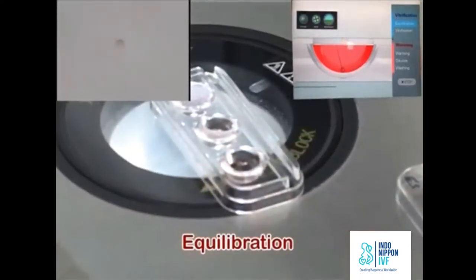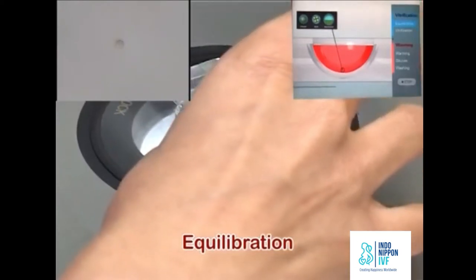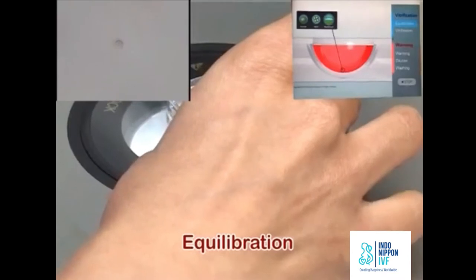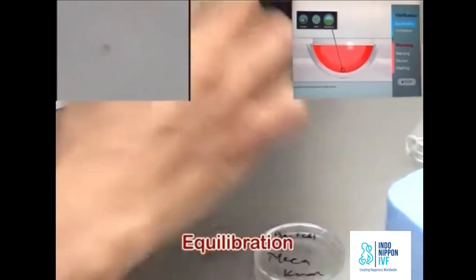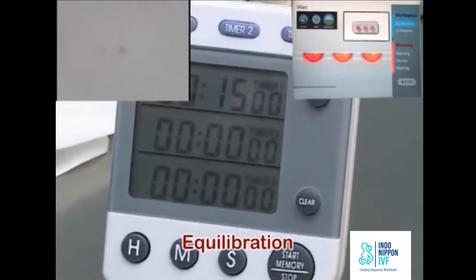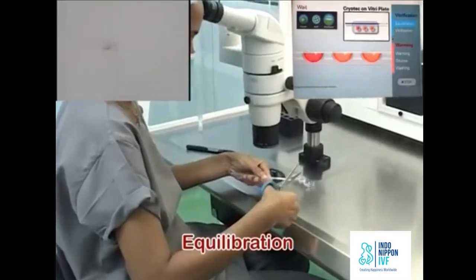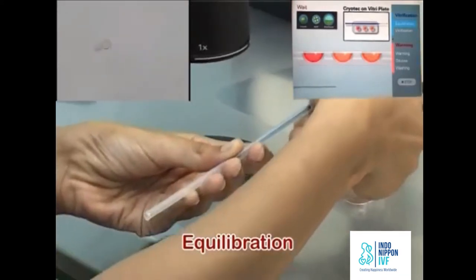As the oocyte sinks to the bottom, it will shrink. Put the lid back on the plate and wait for the recovery of the shrinkage. When the oocyte volume is completely recovered, it is the end of this step. Oocyte equilibration is complete when the width of the perivitelline space becomes equal to the width before immersing into ES.